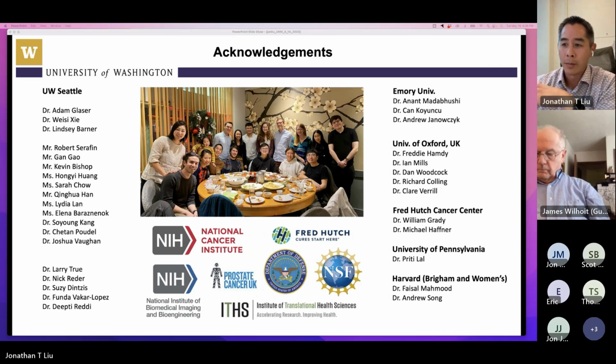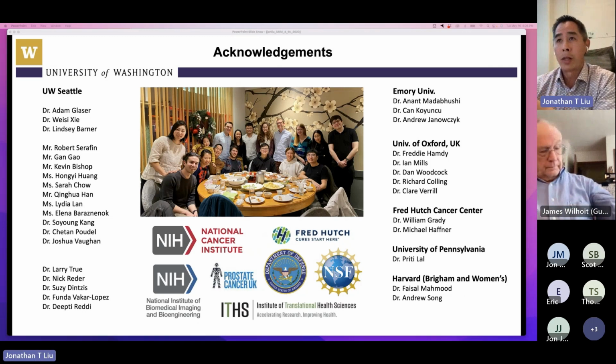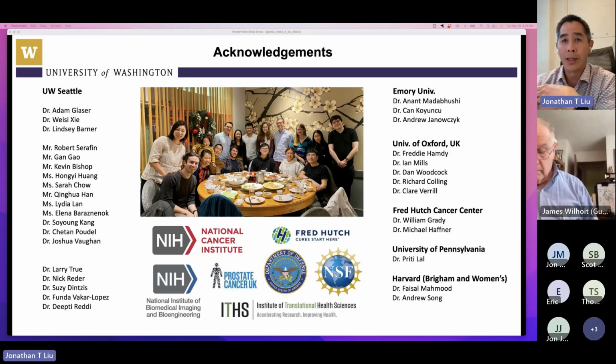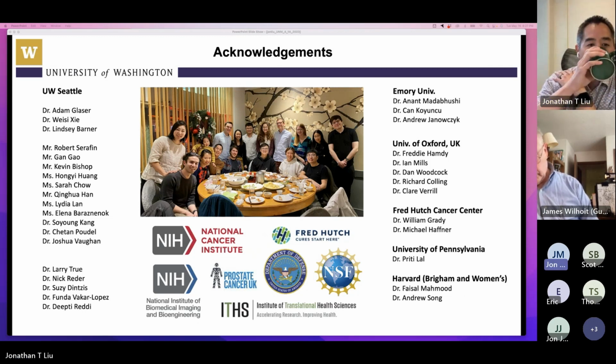For example, 5 years ago, these convolutional neural networks were kind of the state of the art for doing deep learning. Now there's something called transformers, image transformers, vision transformers that are being used, which are actually used for natural language processing. So when you speak into Siri or Alexa, and it's listening to your words and interpreting it, they are often using these transformer networks. And so they're starting to apply those to image analysis as well. But again, I'm not a computer scientist, so I can't give you the full story on that, but we certainly use the tools. Yeah, thank you.